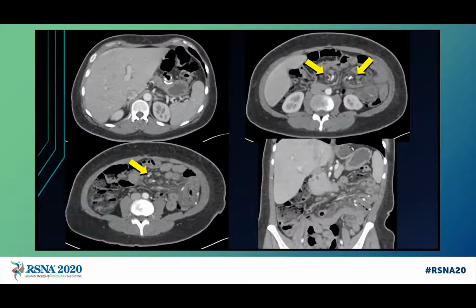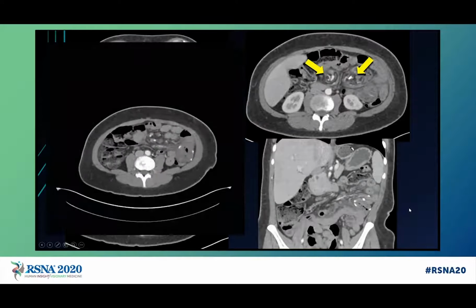Here's another sign of an internal hernia that you notice by looking at the mesentery very carefully. This is a so-called mushroom sign with mesenteric vessels and bowel sort of vertically oriented, making the stalk of this mushroom. This is the site of herniation and the neck of the hernia, if you will. Also notice that the bowel appears slightly edematous. There's mesenteric edema as well, and there is engorgement of the mesenteric veins in this patient.